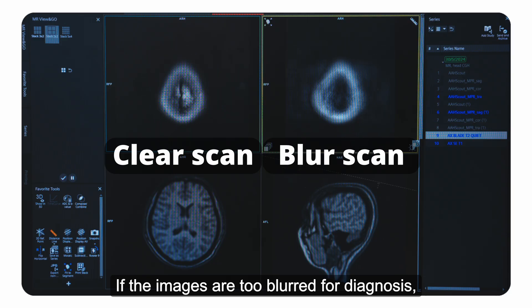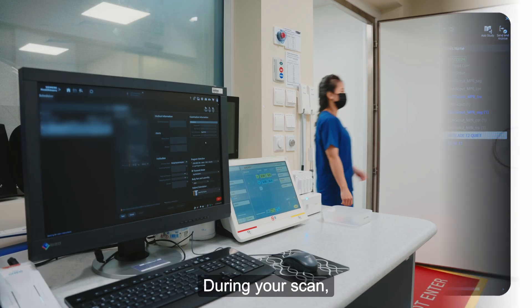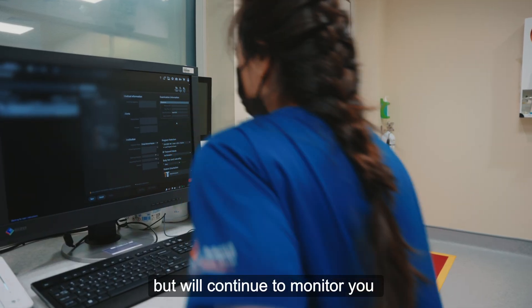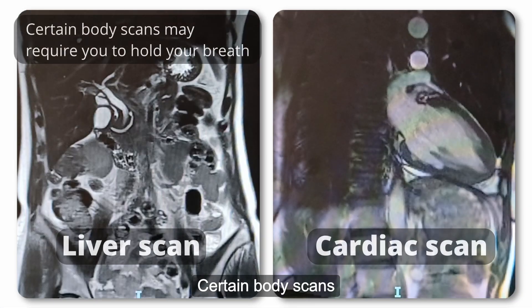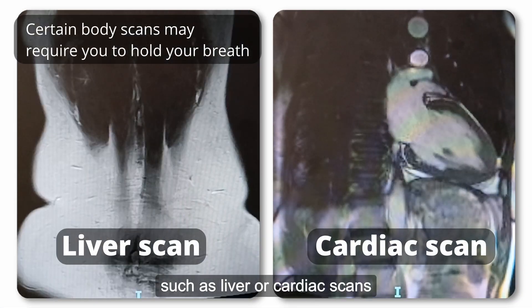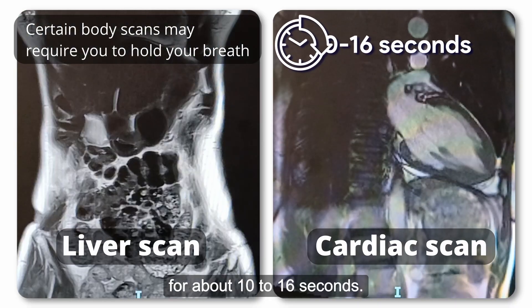If the images are too blurred for diagnosis, your scan may be cancelled. During your scan, the radiographer will leave the room but will continue to monitor you from the control room. Certain body scans, such as liver or cardiac scans, may require you to hold your breath for about 10 to 16 seconds.